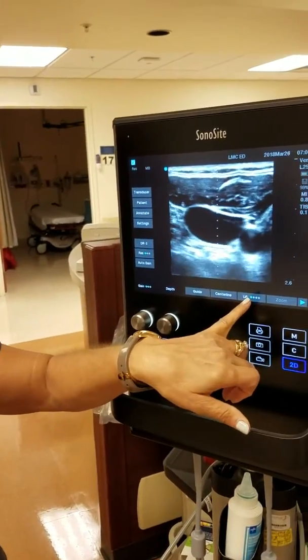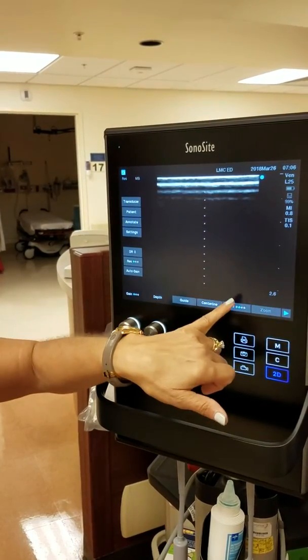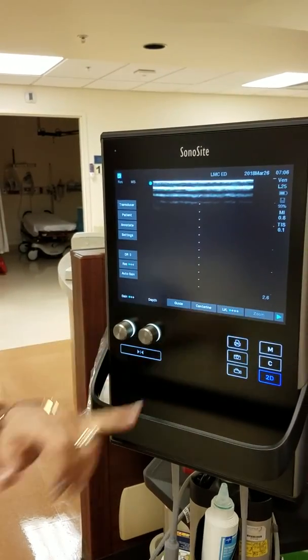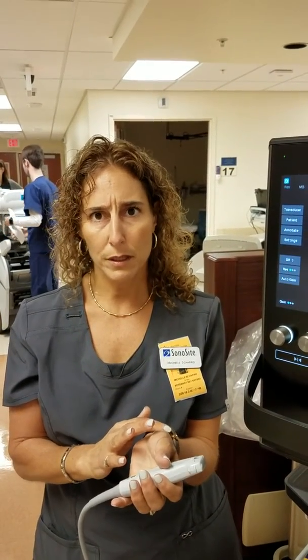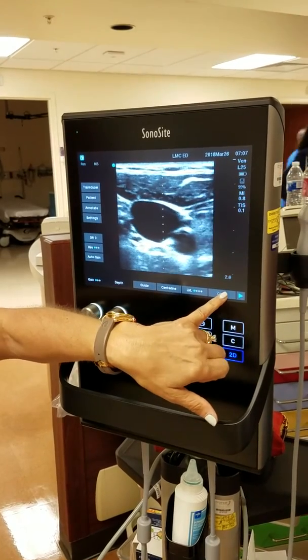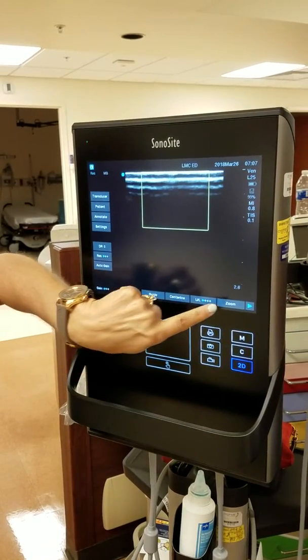This button here is your orientation. Conventionally, the dot is in the upper left, and you can toggle it through all four quadrants: upper left, lower right, lower left, upper right. Zoom is zoom. The only time you'd use zoom is for something like a radial — if you need to see something very small. To zoom, you take the center line off, zoom is then available, move your area of interest up, and hit zoom again.